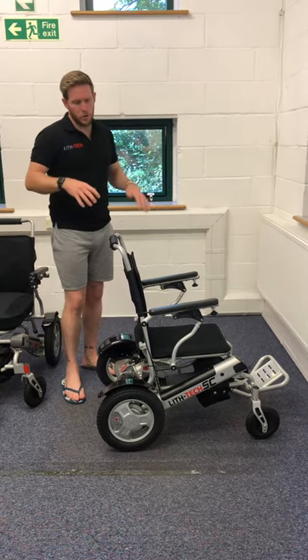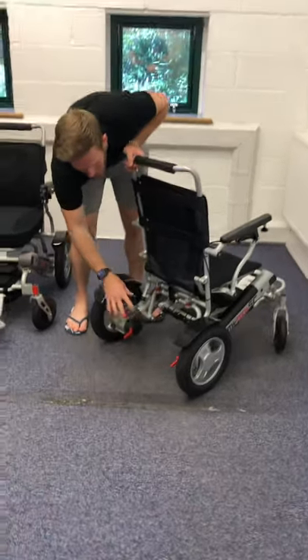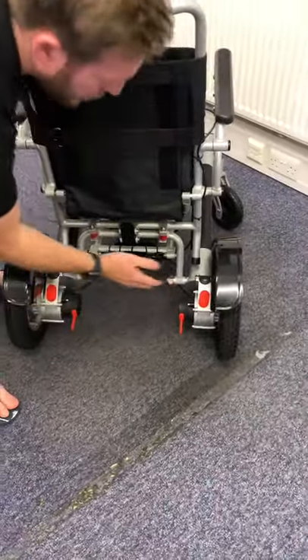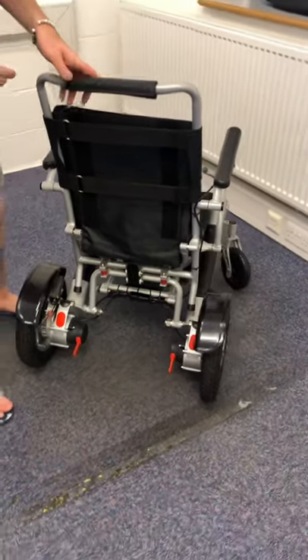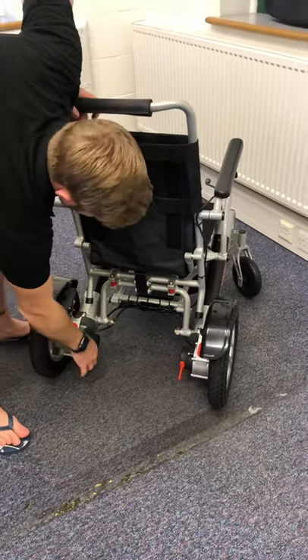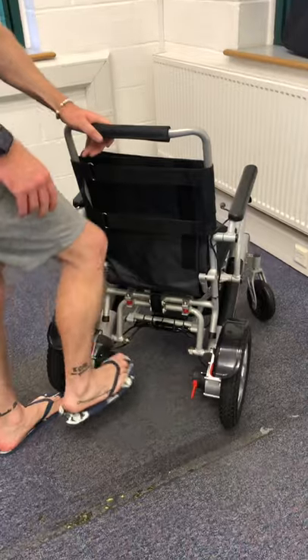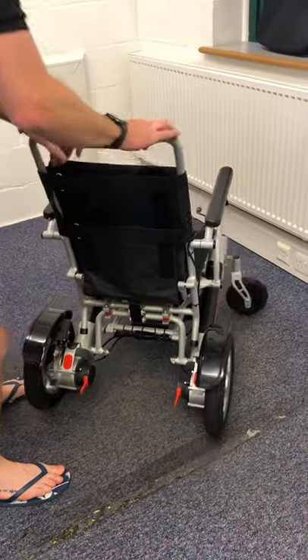Going around the chair — you've got two 250-watt motors at the back. With these toggles down you're in either handbrake mode so the chair is stationary, or when the joystick is attached that's how you use it electrically. To put it into freewheel mode, simply tap these up — you can do this with your hands or your feet — and now you're in push mode.